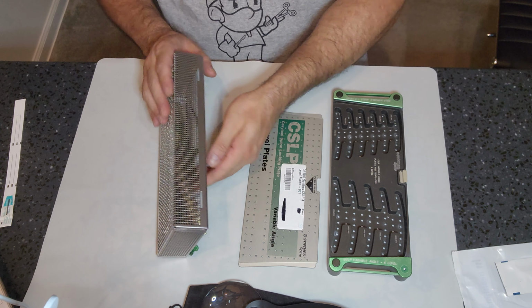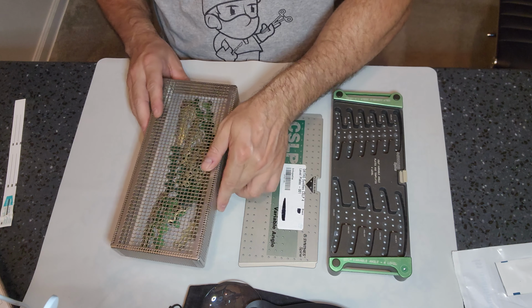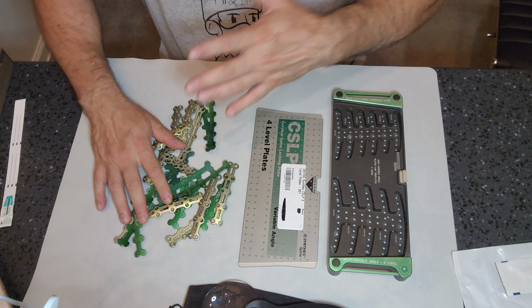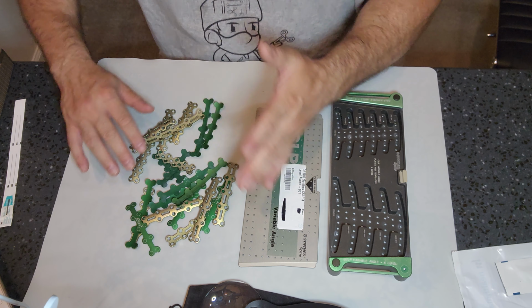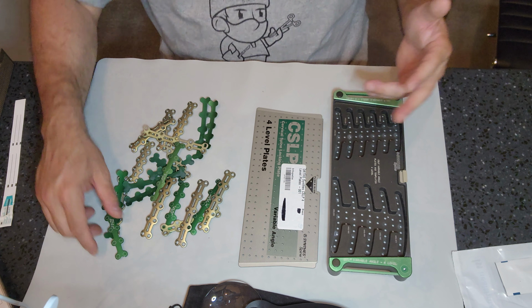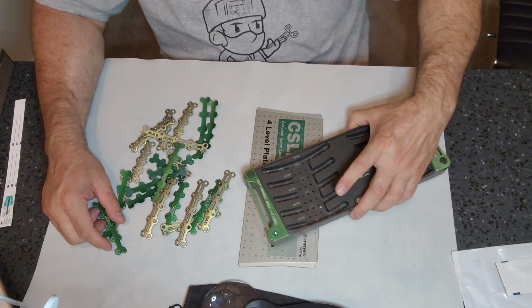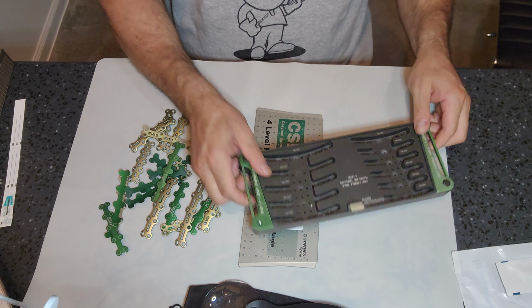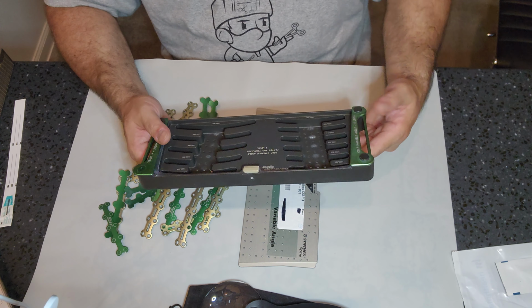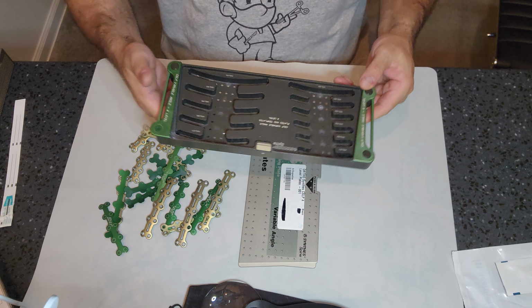Well, I'm going to remove my instruments out of my basket gently here, okay? I know some of you guys don't like dumping. I refuse to dig into trays, all right? So this is my preference. So what are we doing? Okay, so this tray again is very simple, guys. First thing you want to do is inspect your container, right? Inspect your container for cleanliness, for any damages, okay?